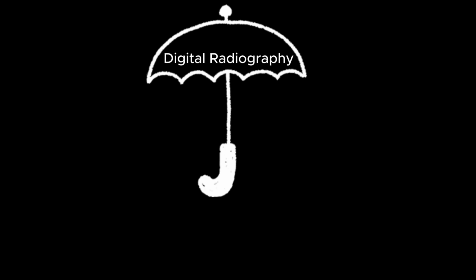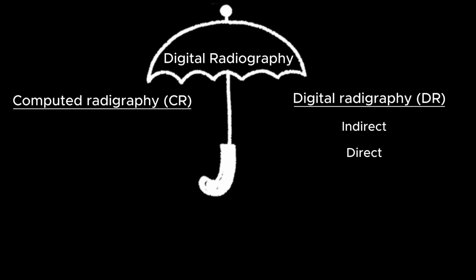All right, so today we're breaking down the differences between CR and DR. That's computed radiography versus digital radiography. From invisible to visible, digital radiography explained. So now under DR, which is digital radiography, we have two branches as well, indirect versus direct. But we're going to go ahead and start with CR because that's where the digital world really began.